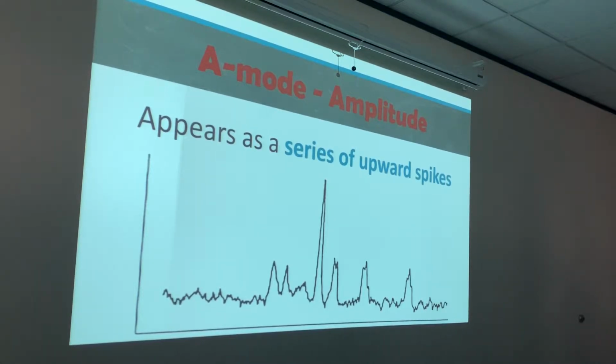Have any of you had to do the crash cart yet? Anybody here had to do a crash cart? When they go to the crash cart and have to check it out, make sure it's functioning properly, you get the little strip, and the little strip kind of looks like this. Whenever they say go grab the AED, like in CPR class, it'll be displayed on that little display, just like this, as a series of upward spikes.